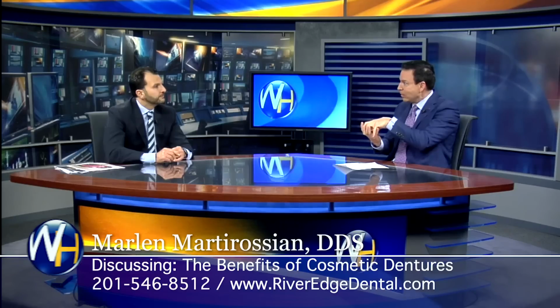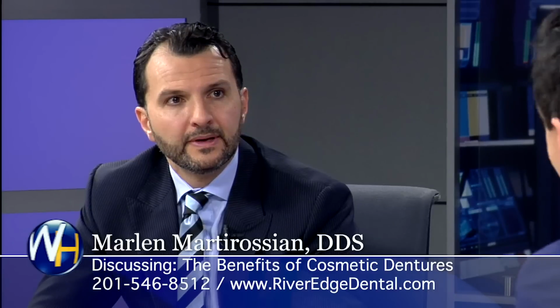Backing up just a moment. So traditional dentures, they basically just put a mold on the ridge of the gum line, and that's it. With this, you're taking into account their face, the way their teeth come together. Is that what you're saying here? Yeah. Okay. Sorry. Keep going.